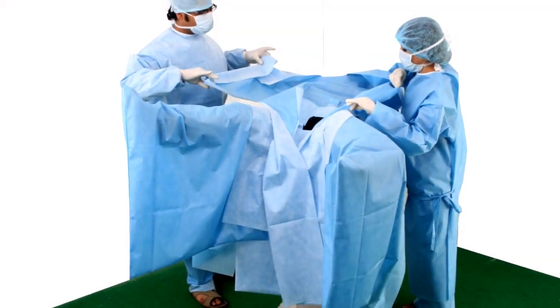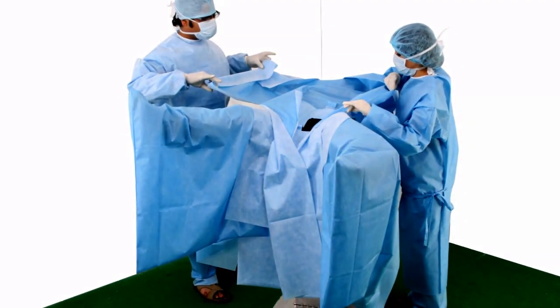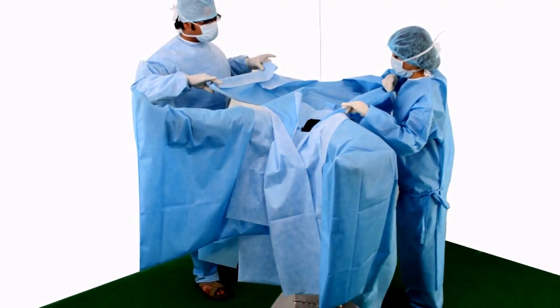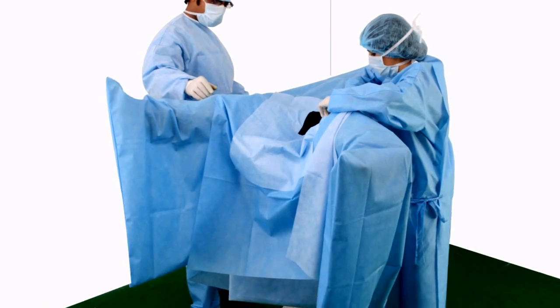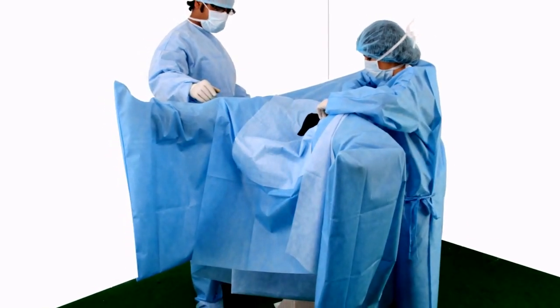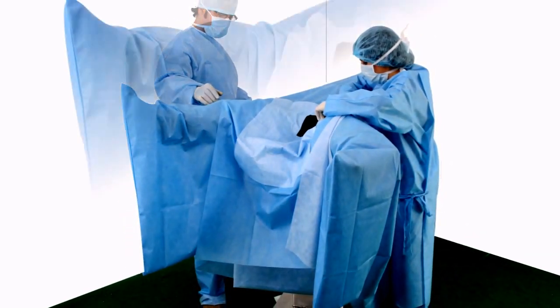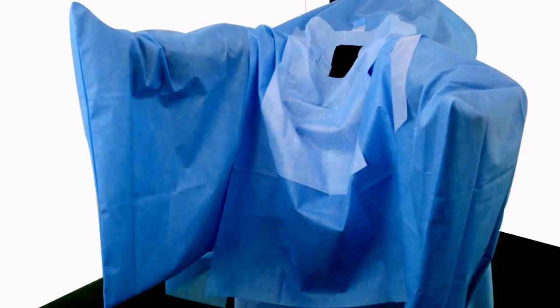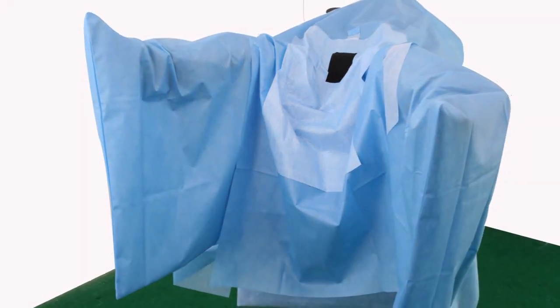Unfold drape toward head and sides. Firmly seal edges of fenestration to patient's skin. Insert surgical tubing to complete draping.